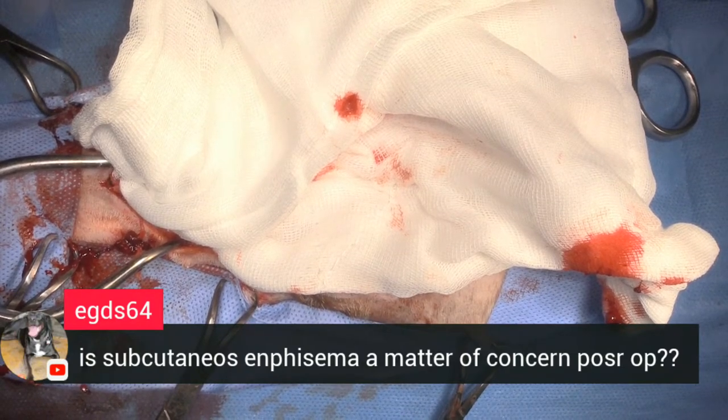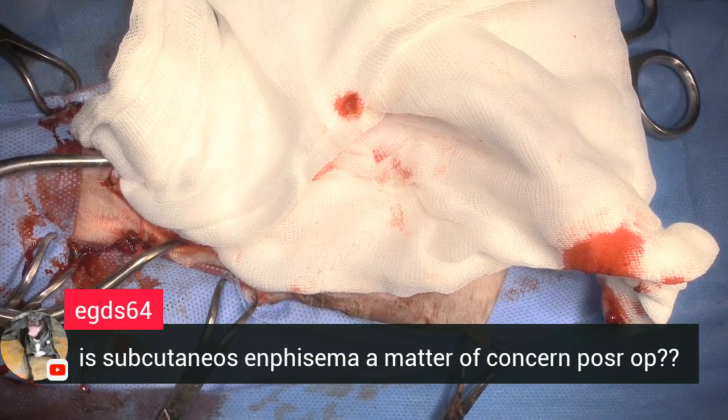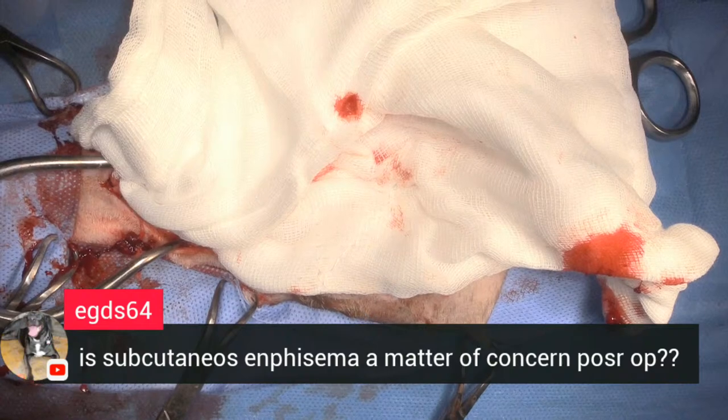Hello. Hey. How far off are you? Probably 15. Have you looked at plates for your fracture? Is my fracture next? Yes. I haven't looked at the fracture yet, so I have no idea what it looks like. Can I knock it out inside treatment anyway, or do you want to wait and see? You can probably knock it out. That's fine. I can take some 2-0 PDS, please.